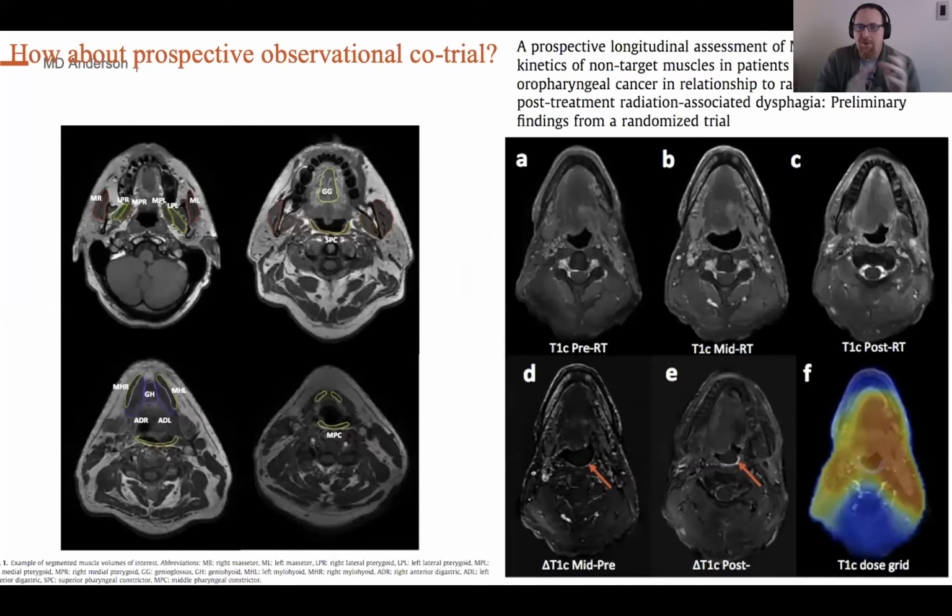So we ran a prospective study on our proton cohort where we collected the same surveillance imaging, but we substituted a T1 and T2 map MRI. So that instead of getting semi-quantitative T1 weighted and T2 weighted images, we actually had something that we could very reliably quantize in terms of the changes in the image intensity. What's important there is we picked sequences that we calibrated with the radiologist so that they could still use them for all of the surveillance stuff they'd wanted to use anyway. And what we were able to see was that that effect held true. You could still see on treatment, you saw edema and inflammation. But after treatment, this fibrotic effect was quite visible and could be related to the radiation dose quite readily.